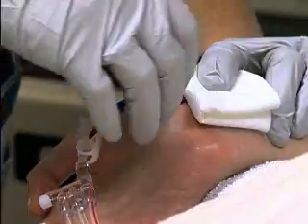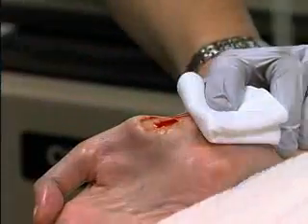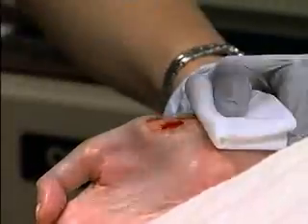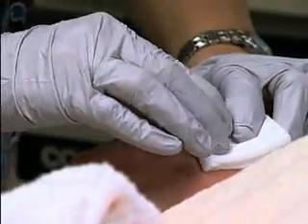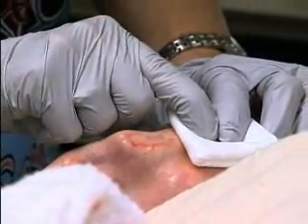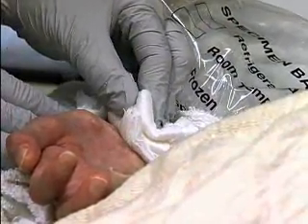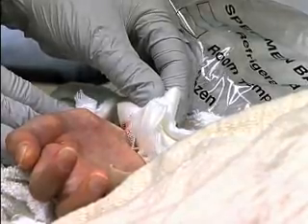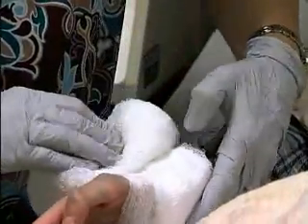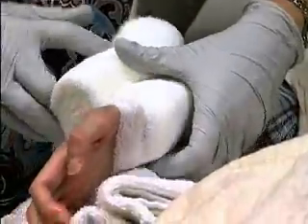After the treatment is done, we remove the catheter. Pressure is applied with gauze for about 2 minutes or so, depending upon how long it takes to stop the bleeding. Sometimes we apply ice bags over the site, which helps to stop the bleeding. And once we know that the bleeding has stopped, then we apply pressure bandage over it. And the patients usually go back to work after the treatment, or they can use the wrist.